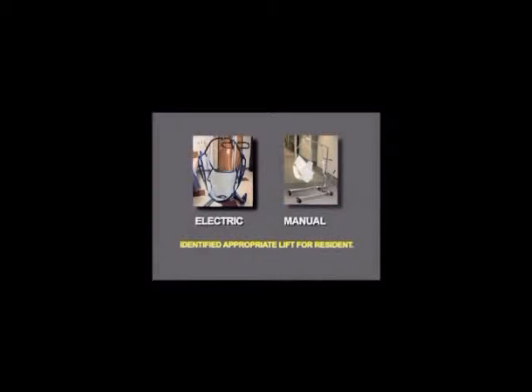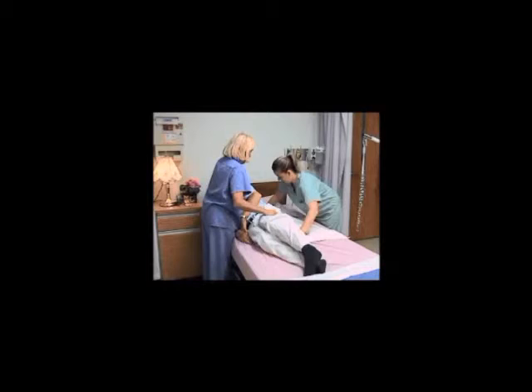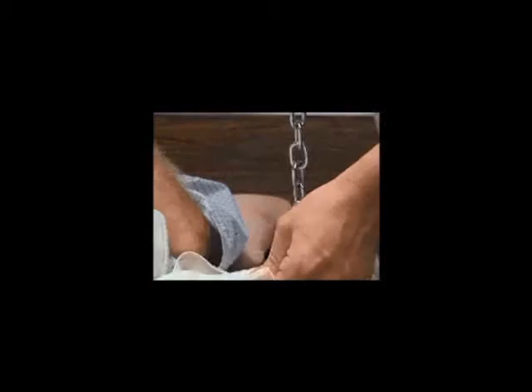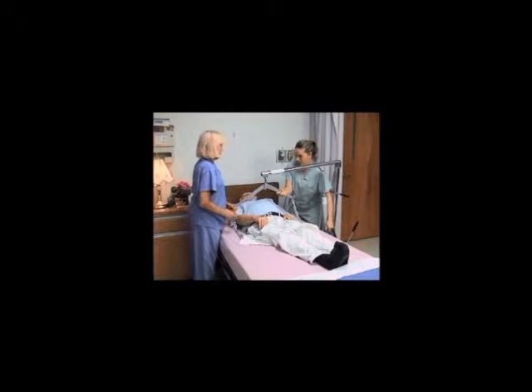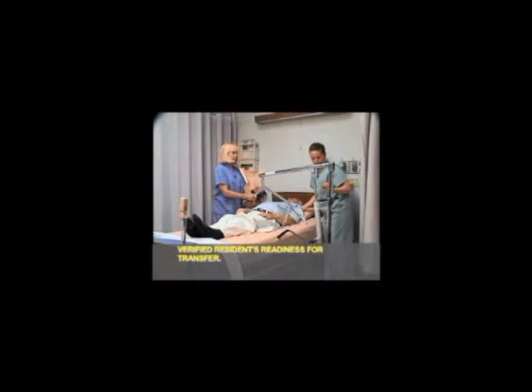Identified appropriate lift for resident. Applied correct sling belt. Attached sling belt to mechanical lift. Now we're going to slowly lift you. Verified resident's readiness for transfer.